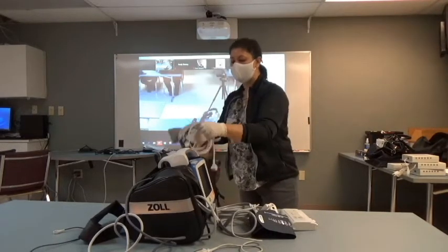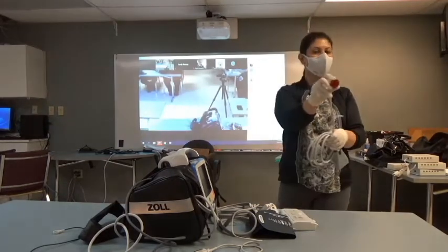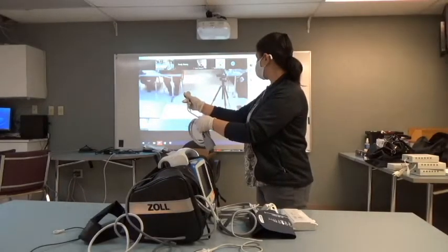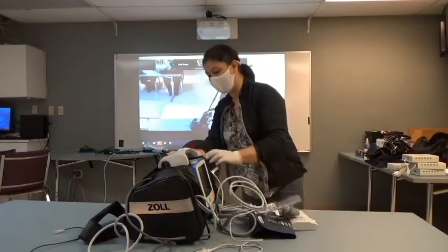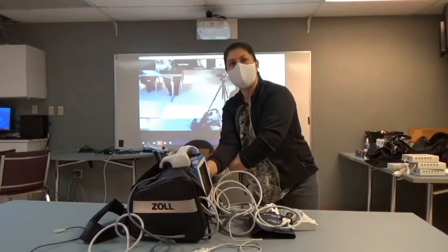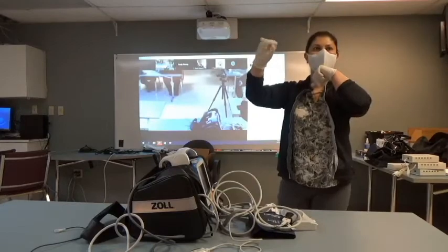So this multifunction cable has this little white triangle on the end. There's also one in the device. If you ever need to disconnect this to clean it, you're going to line those both back up and you're going to push. And then I like to just lock it into place by turning that red dial to the back.